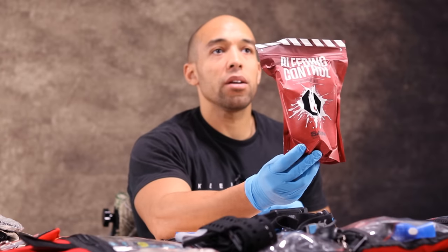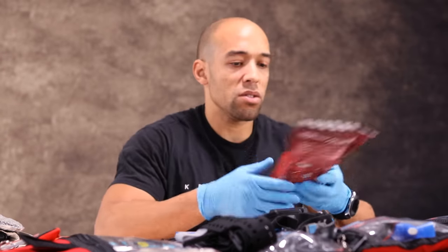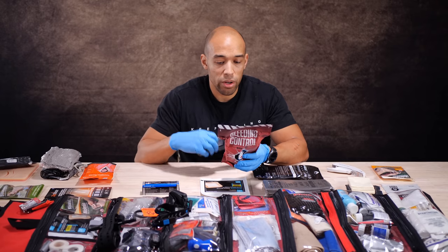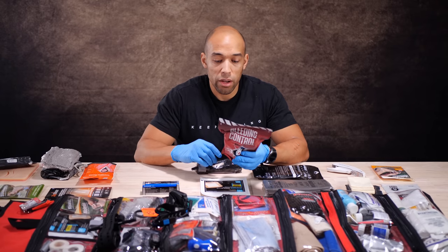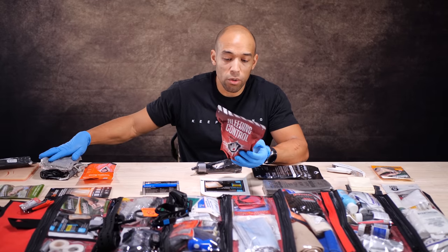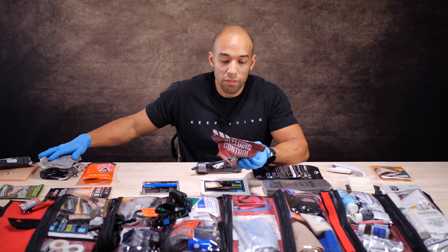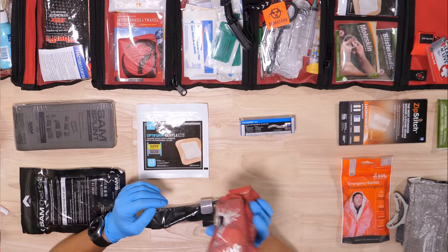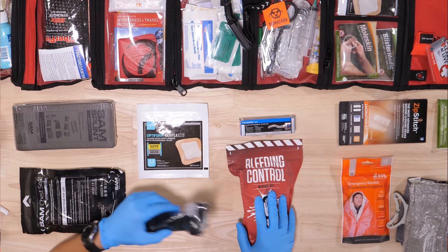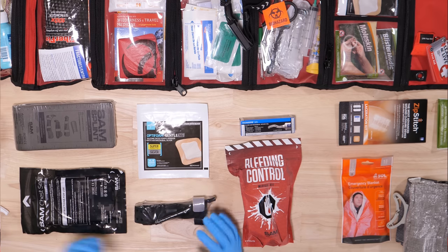If you want to get everything in one package, I'd recommend this bleeding control kit. You don't need any sort of medical license to purchase it — you can get it at canadianpreparedness.com. It includes the SAM XT tourniquet, medical shears for cutting open clothing, an Israeli emergency bandage or similar, a permanent marker, compressed gauze, medical gloves, and an instruction card. Everything you need in a vacuum-sealed package, with all individual components vacuum-sealed as well.